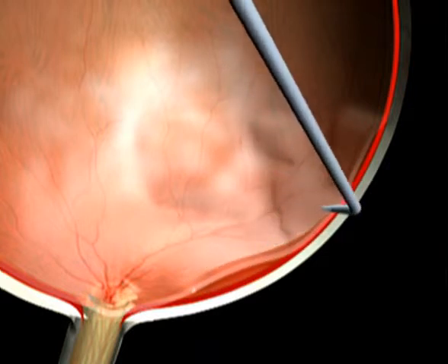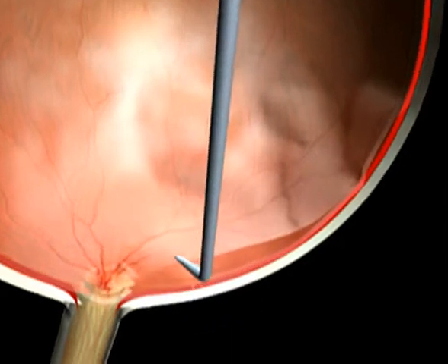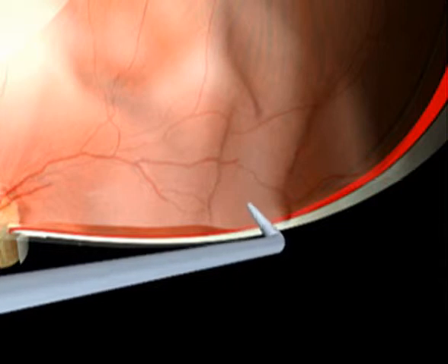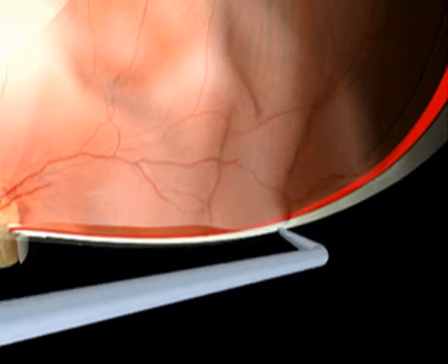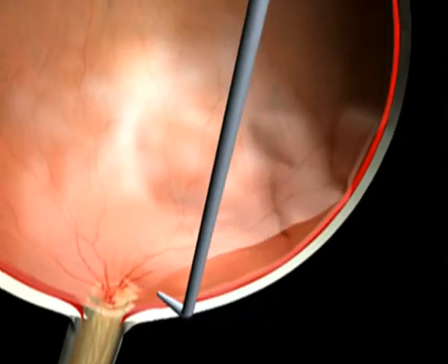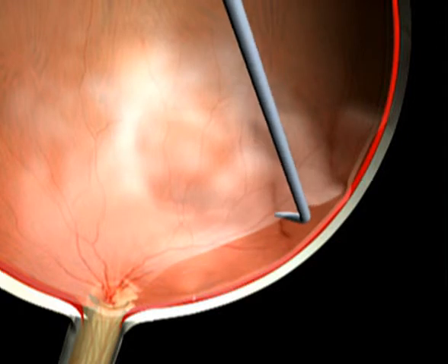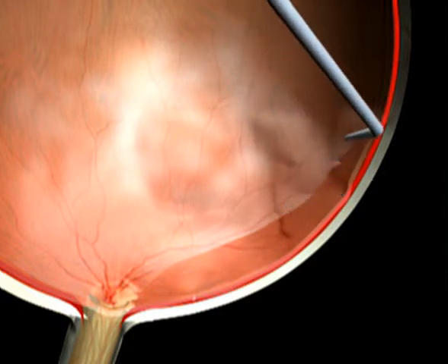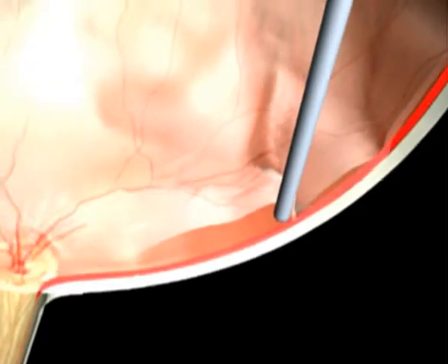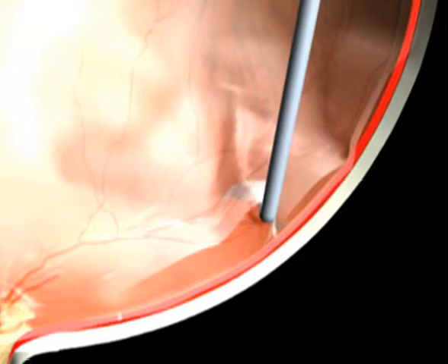When reaching the adherents, we must take care to have the hook face backward. It must slip if the adherence is too strong. It is only used to delaminate in the anatomical plane of cleavage, not to pull up the membrane. With a grasping effect as produced by forceps, we could take the risk to tear the retina and complicate the surgery.